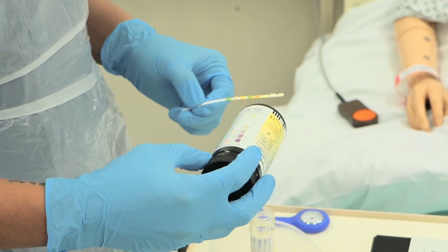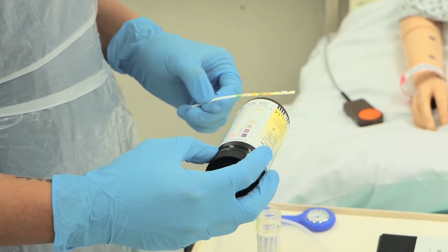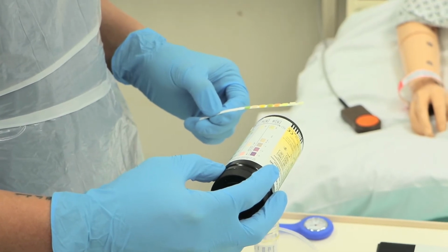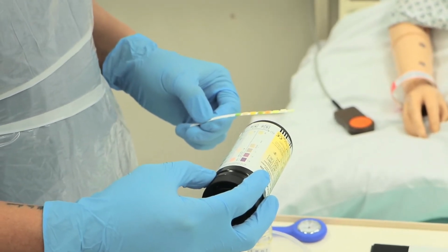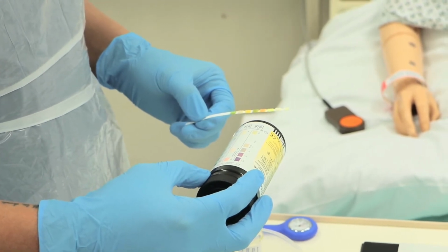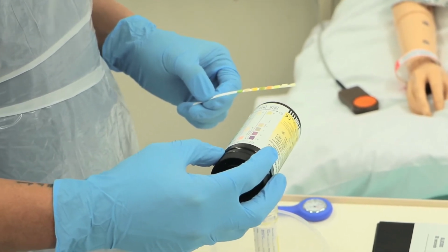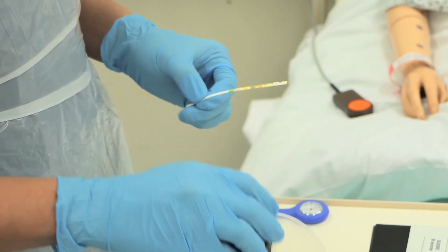And another 1 full minute for leukocytes. 1, 2, 3, 4, 55, 56, 57, 58, 59, 60. Leukocytes is negative. So now I can dispose this one to the clinical waste bin.